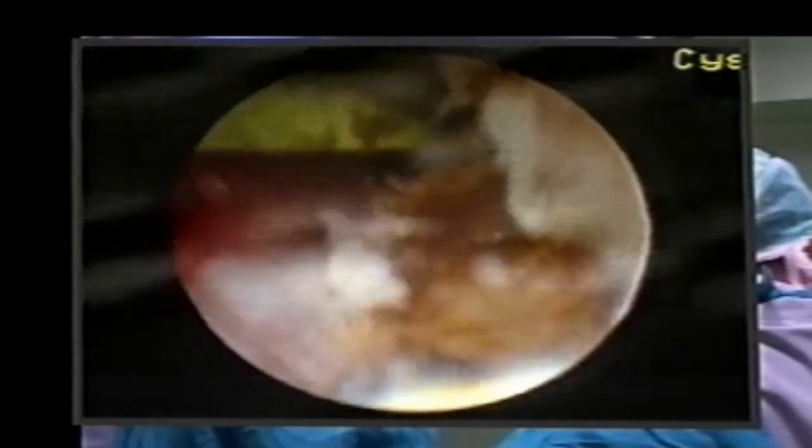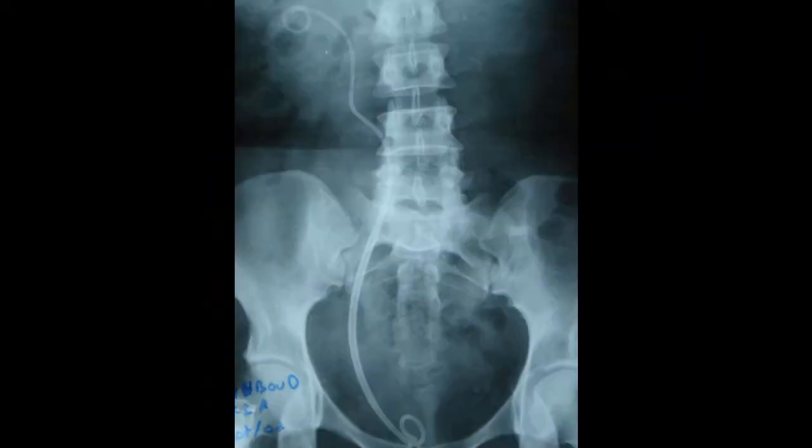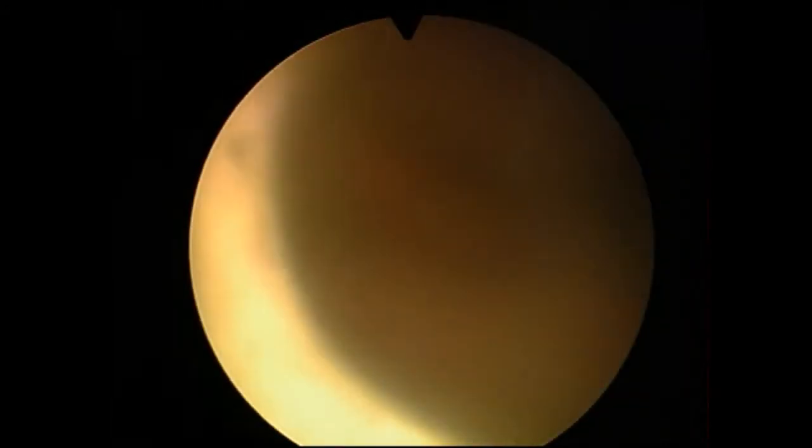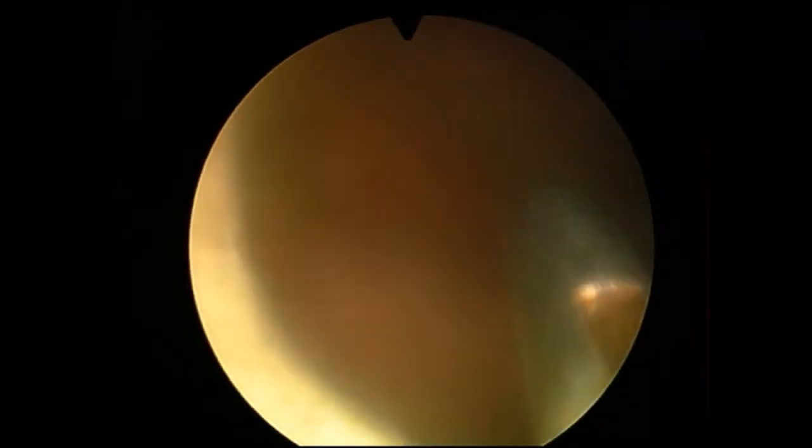The incision continues until being largely below the stricture, and the ureteral wall is incised until reaching the fat. A double-diameter 14/7 French JJ stent is then placed. Three months later, cystoscopy is performed.